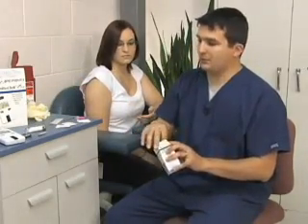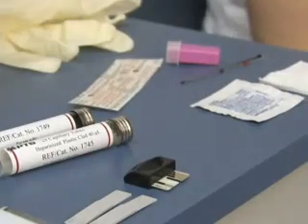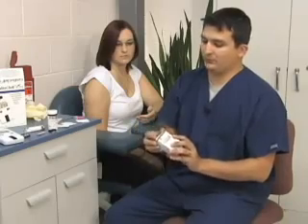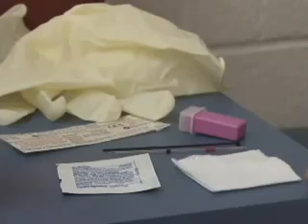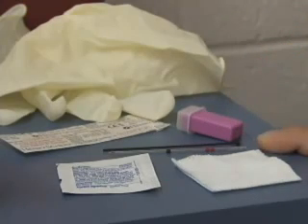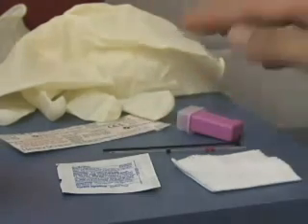Located inside the test strip box are also several items: the lot specific memo chip and then the vial of test strips. You will also need some additional items to test such as gauze, an alcohol prep pad, finger lancets, glass capillary collection devices, band-aids, and gloves.